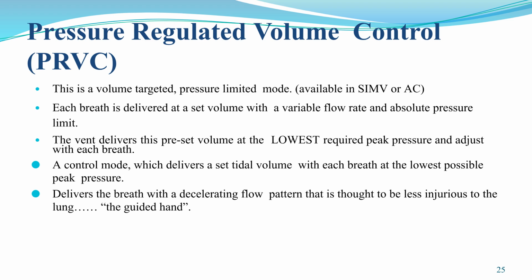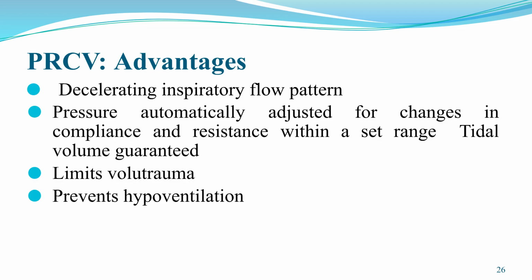Pressure-regulated volume control, or PRVC, is a volume-targeted pressure-limited mode. It delivers a set volume with the lowest required peak pressure and adjusts with each breath, often with a decelerating flow pattern. Advantages of PRVC include a decelerating inspiratory flow pattern and automatic pressure adjustment for changes in compliance and resistance. It guarantees tidal volume, limits volutrauma, and prevents hypoventilation.